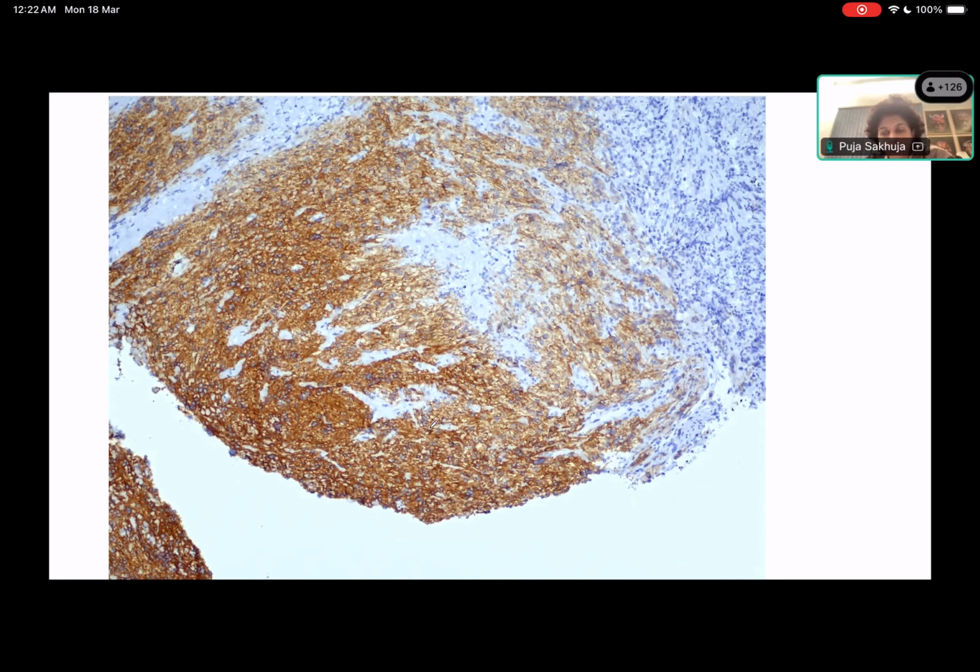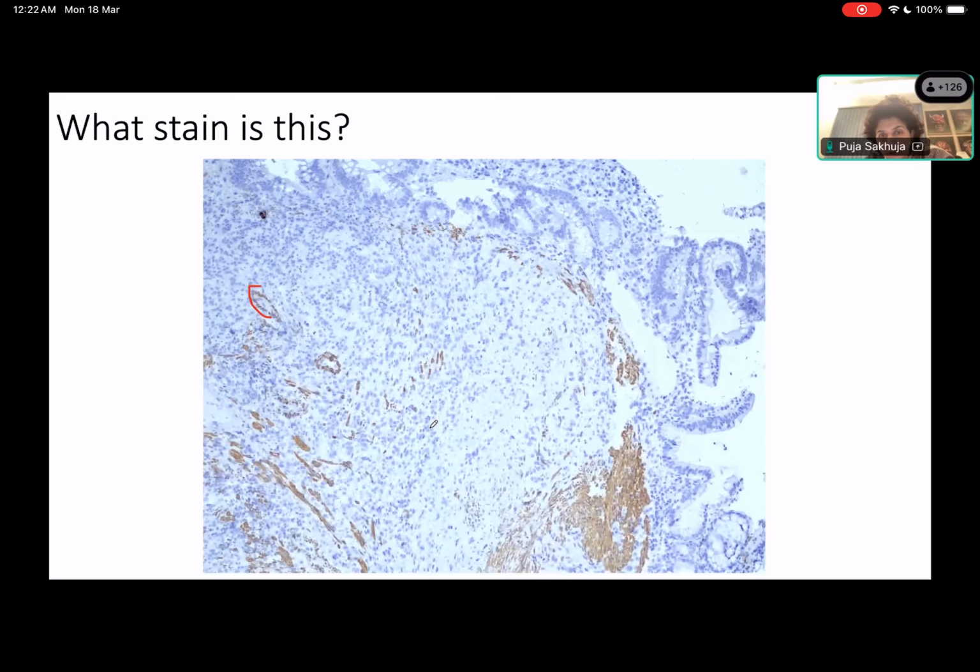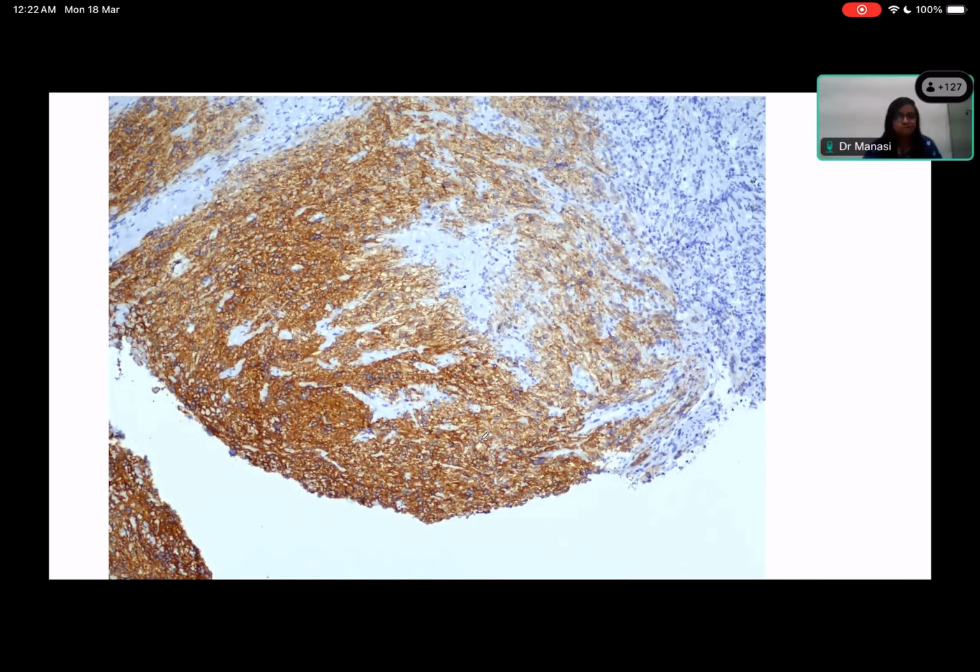Okay. So with the CD117 positive and SMA negative in the lesion. Now, can SMA come positive in GIST? No. It can actually. SMA can be positive in GIST in about, I forget the figure, but maybe about 30% of the cases, SMA can be positive.